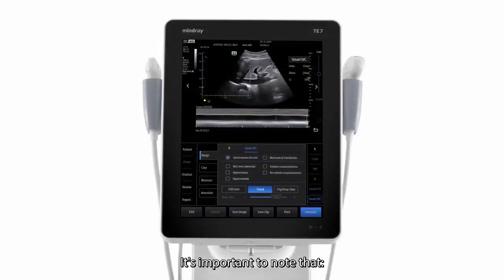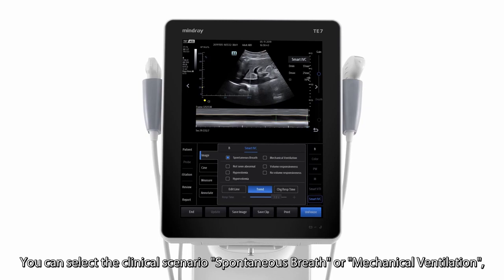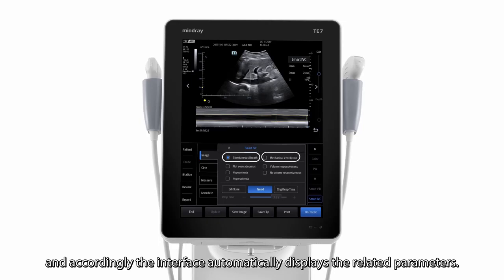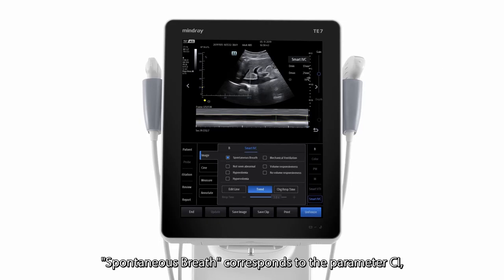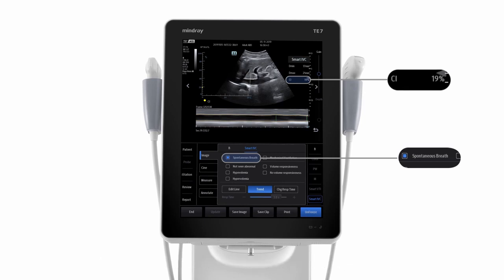It is important to note that you can select the clinical scenario — spontaneous breath or mechanical ventilation — and accordingly the interface automatically displays the related parameters. Spontaneous breath corresponds to the parameter CI.